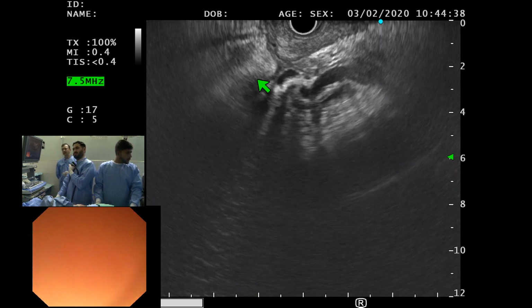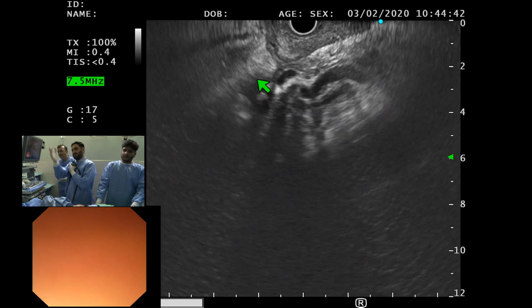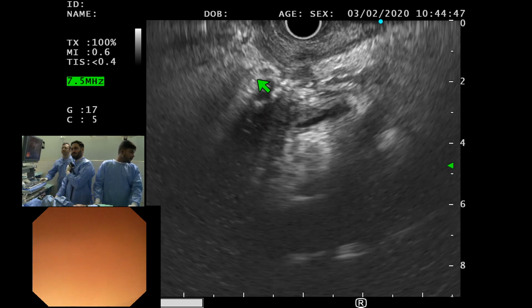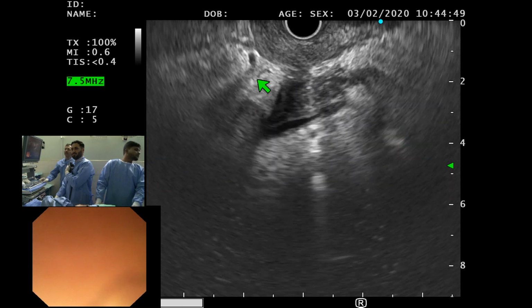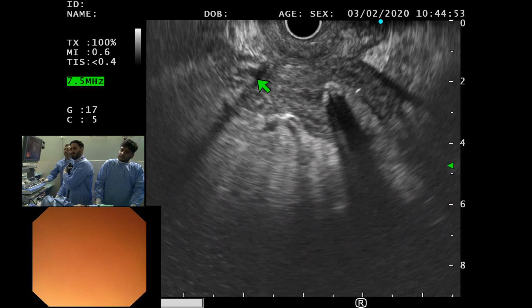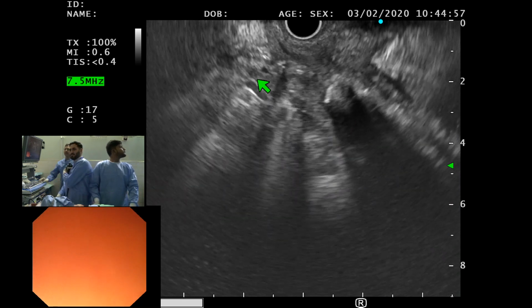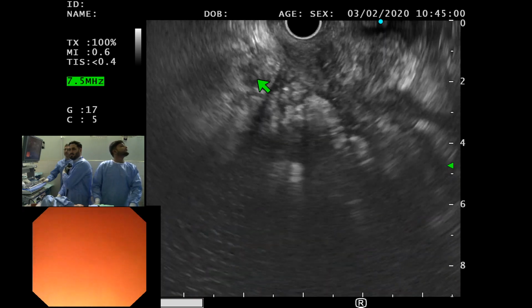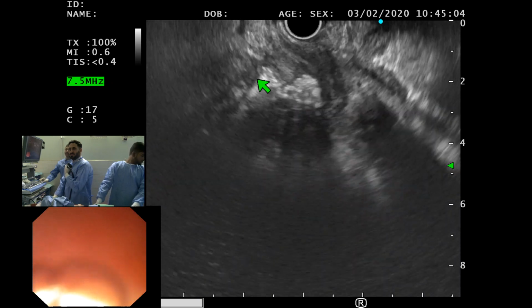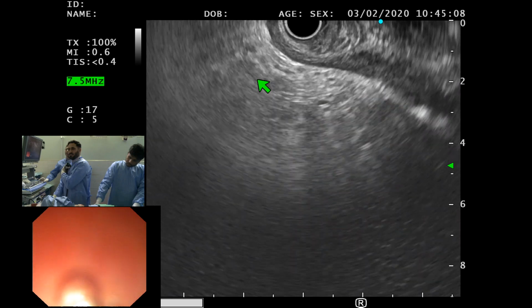These are recognizable structures. You can see that there are certain blood vessels. Okay. You see that there are white and black shadows, meaning by that fluid is there, necrosis is there. Go according to the anatomy.